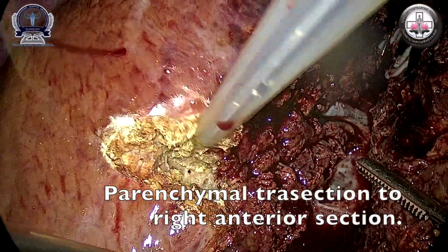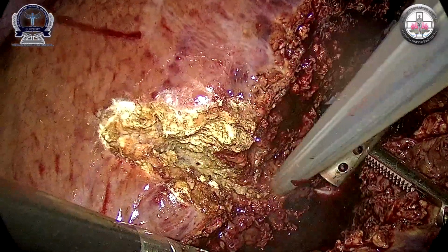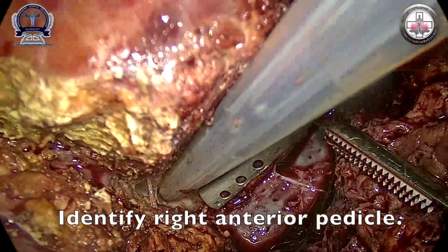After the hepatic vein of segment 5 was found, parenchymal transection was performed at the anterior section of the liver to identify the right anterior portal pedicle.